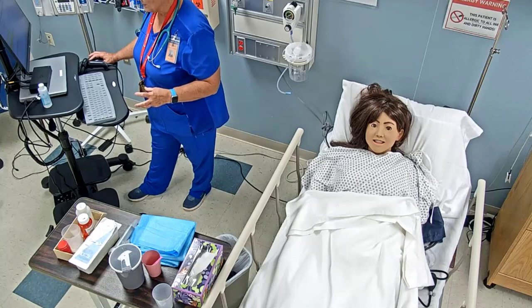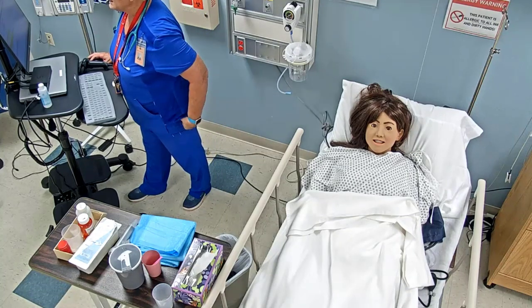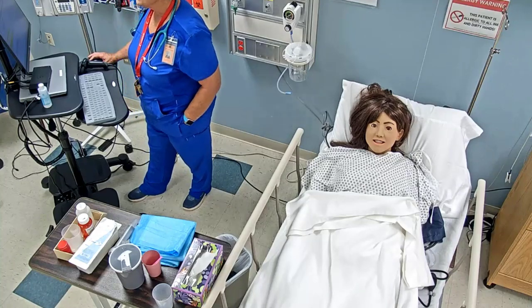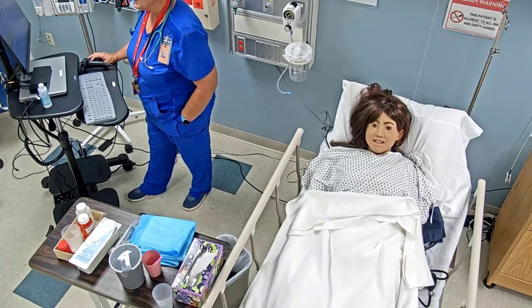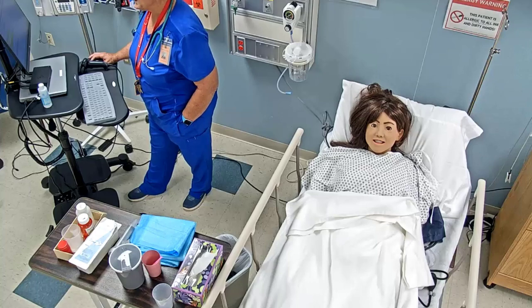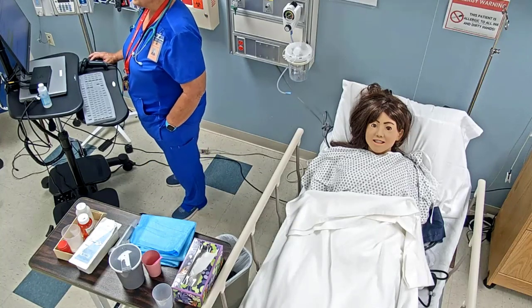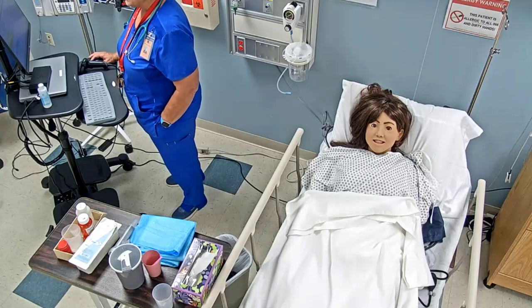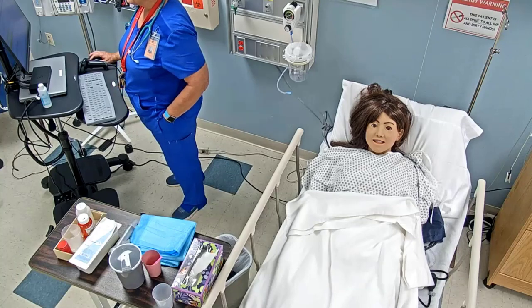and then we're also going to be checking our policy and procedure. So I've got Anna Taylor, date of birth 4/24/1991, drug allergies, no known drug allergies. And so I'm going to be checking her orders today. We're going to be giving her metoprolol 100 milligrams PO daily per PEG tube, Pepcid 20 milligrams oral suspension daily per PEG tube. Flush the PEG tube with 15 mLs of water before and after each medication.